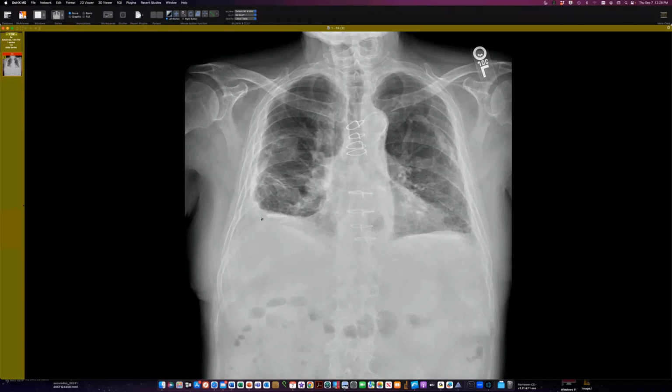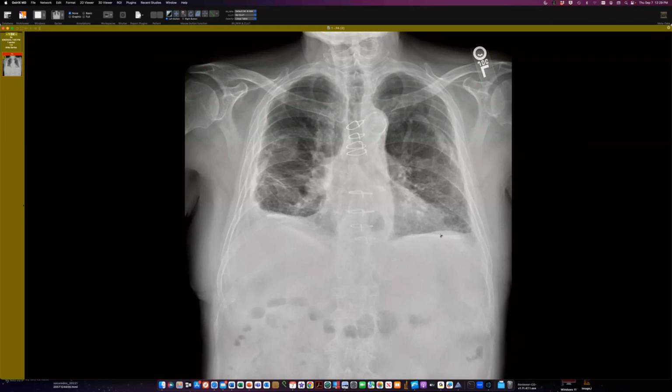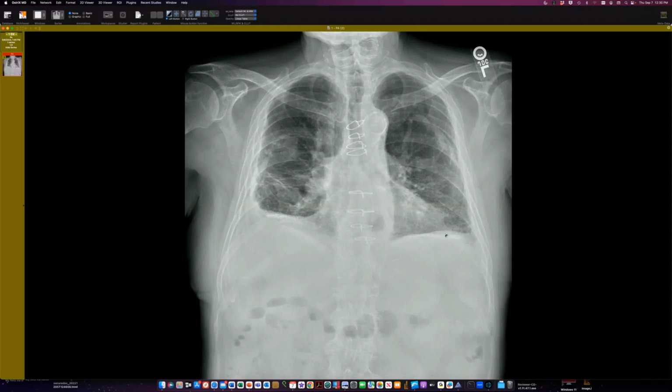This person has plaque as well. Here's a calcified en face plaque up here. Here is diaphragmatic plaque on the right and diaphragmatic plaque on the left. So we have pleural plaque and we have diffuse pleural thickening. So that's the blunting of the costophrenic angles. Unlike plaque, diffuse pleural thickening can cause lung restriction. So it's actually compensable, whereas pleural plaque by itself most state agencies won't compensate a worker for having. Diffuse pleural thickening or asbestosis do get compensation though.